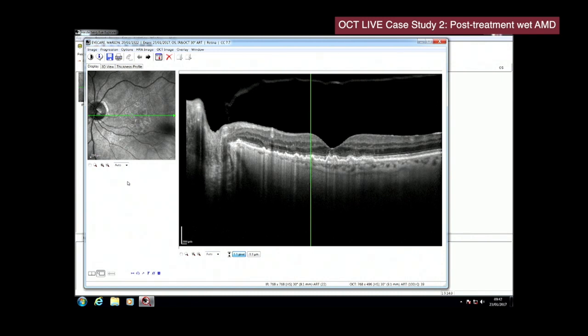I think if you can monitor the patient with serial OCTs, every month or every 2 months, they can monitor it. And as he suggested, if you see any recent hemorrhage at the macular area, or some subretinal fluid or intraretinal fluid, or if the patient themselves complains of any distortion, then that means something is going on.